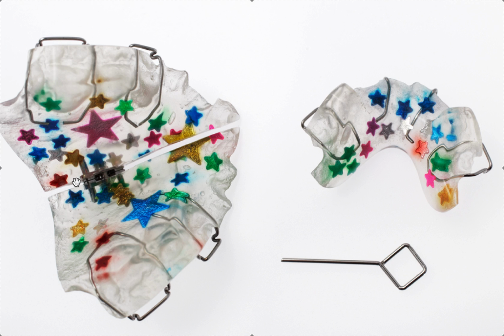MacNamara twin block. Of course, MacNamara is super into arch expansion, which I love. So it's going to have one or more screws here. Of course, you can do all kinds of variations. You can turn it into a sagittal. You can upright molars. You can push out the premaxilla.